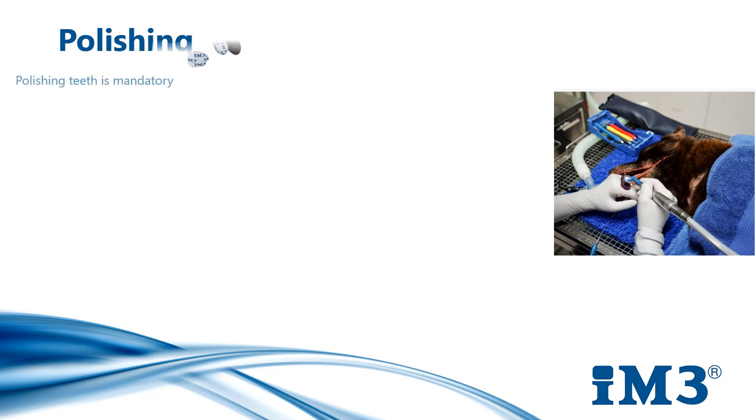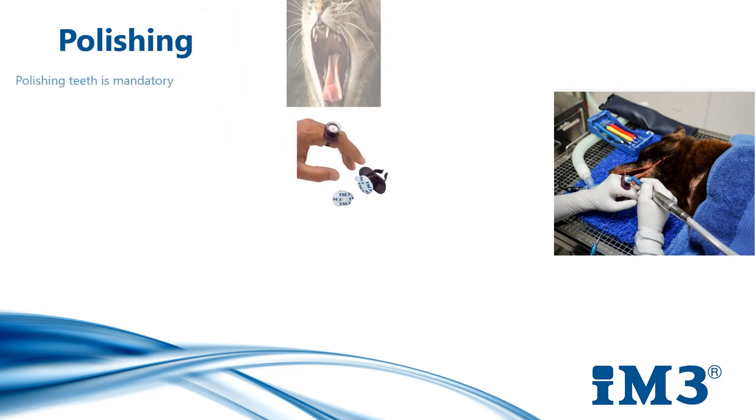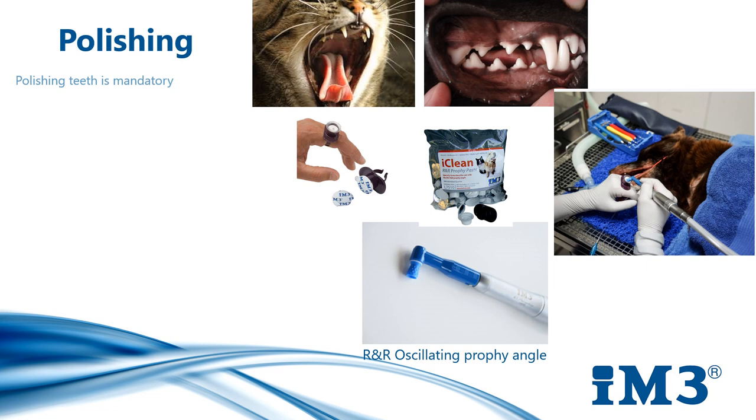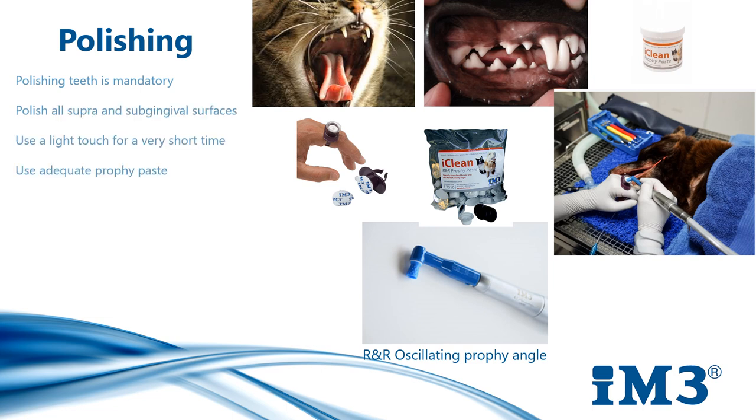Polishing our patients' teeth is mandatory — we must polish all supra and subgingival surfaces. A common misconception in veterinary dentistry is that ultrasonic scaling leaves the tooth and root surface rough. However, if we're scaling properly, we shouldn't damage the enamel. Tooth enamel is the hardest substance in the body, so a rubber cup containing prophy paste cannot smooth enamel. It is really important to finish the procedure with polishing as this removes any remaining plaque or biofilm that sits under calculus.